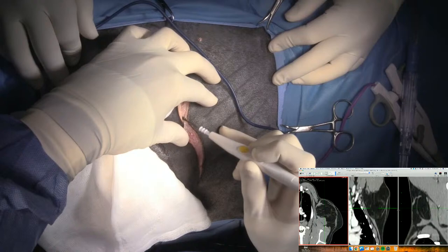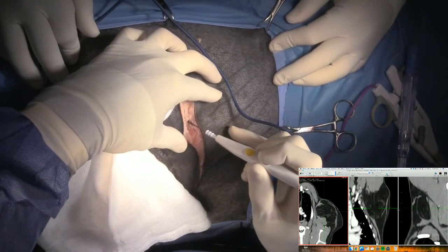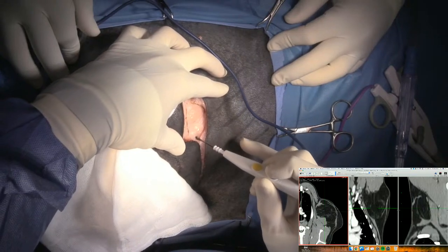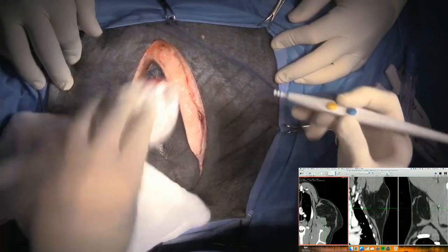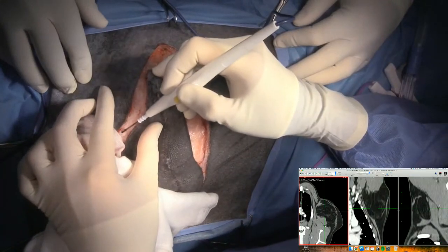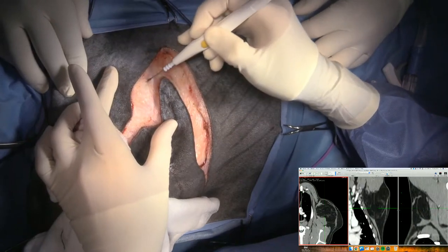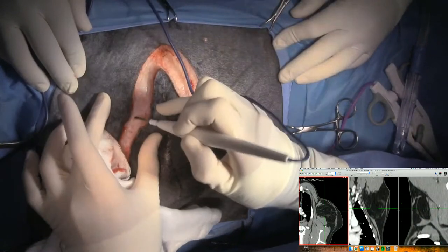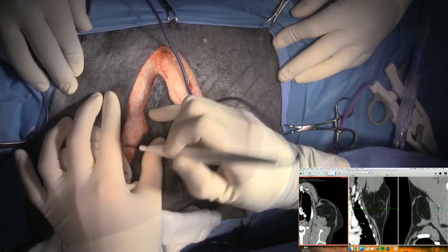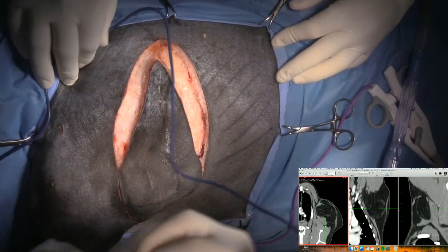So I'm cutting through the cutaneous trunci muscle here. And this tumor is only infiltrative in the latissimus dorsi. Otherwise, it's just going to shell out like a normal lipoma. Can you get cautery turned up to 30, please?